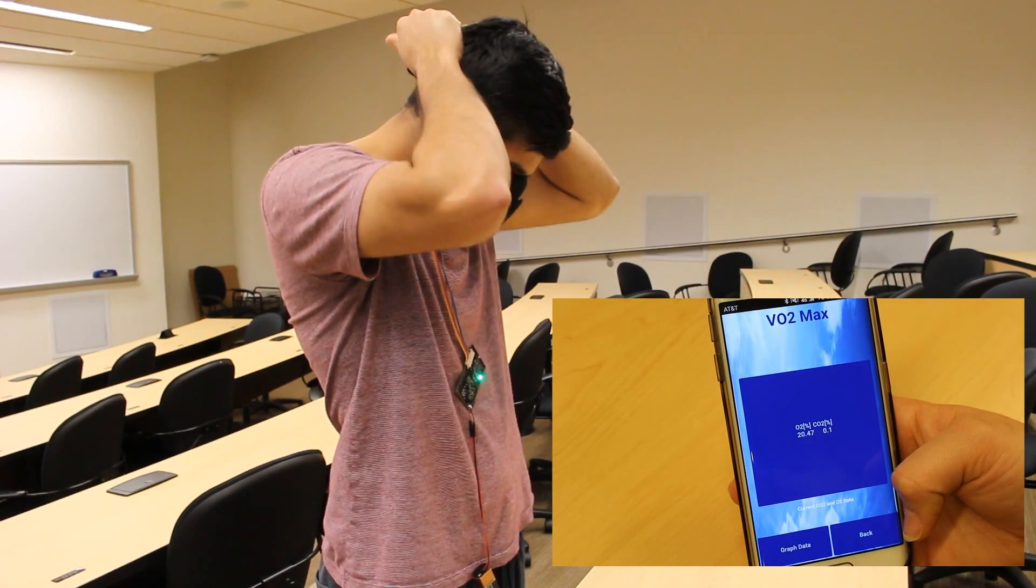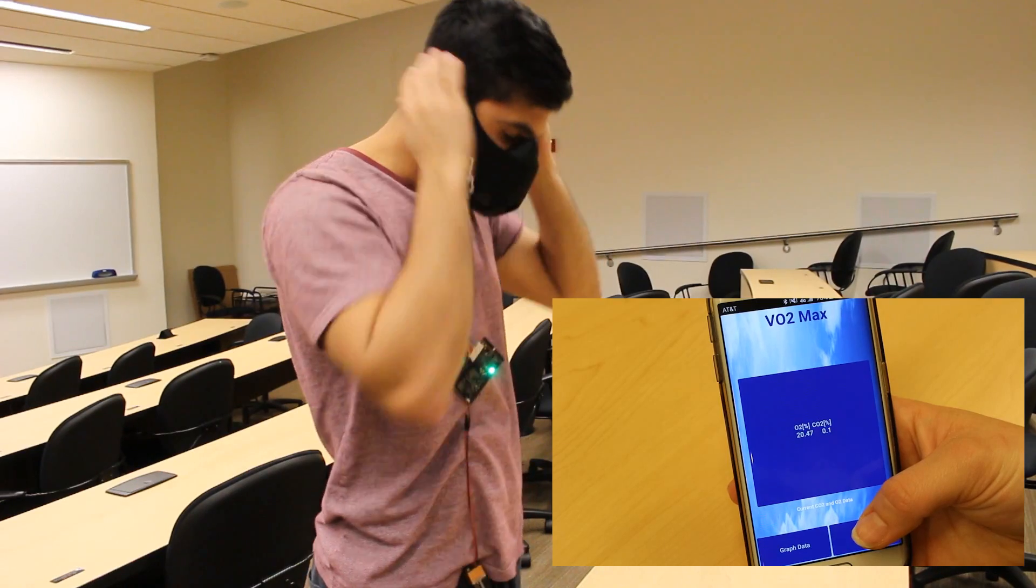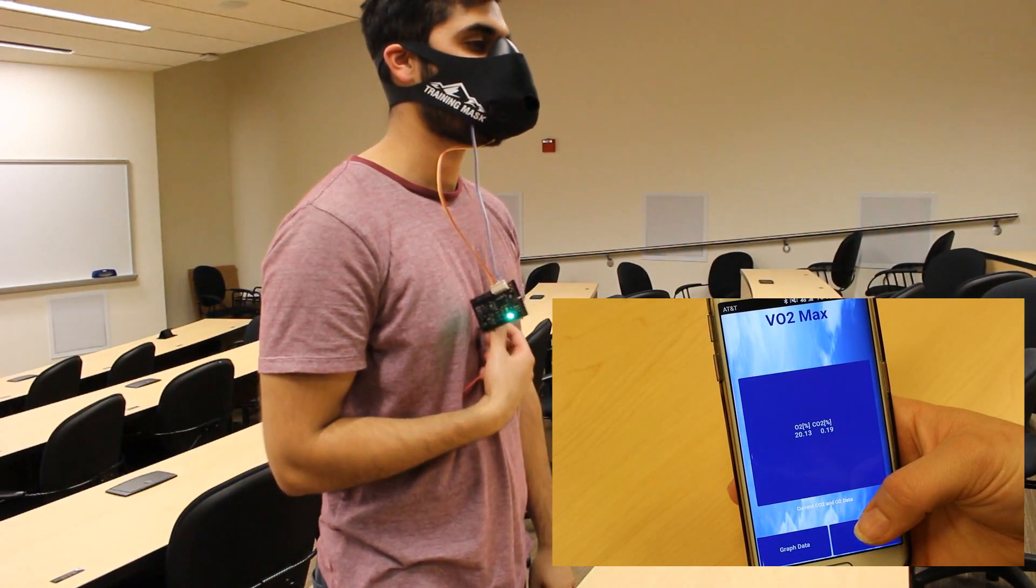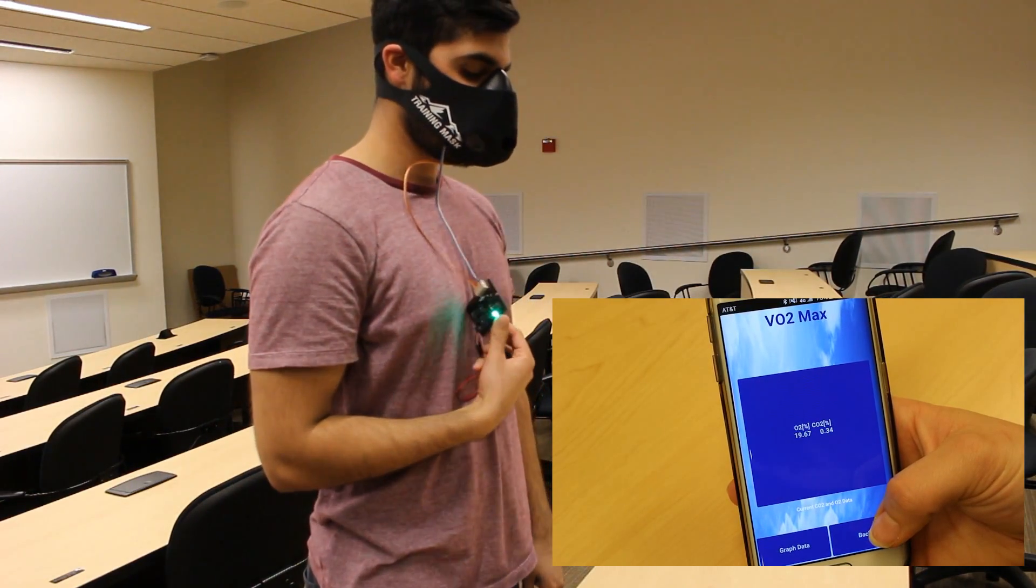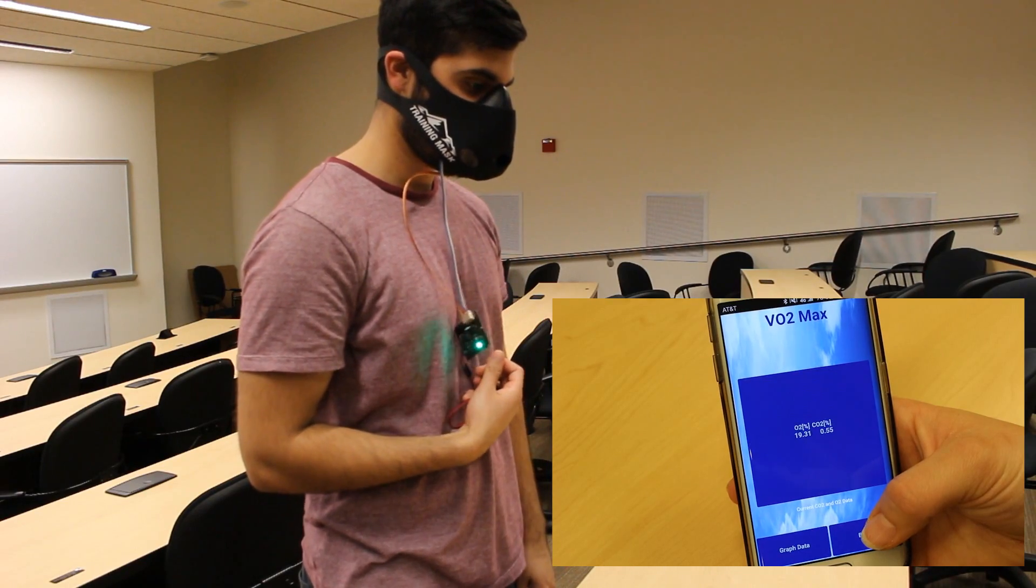You will also be able to see the live data updates directly on your phone through the Uku app as the CO2, O2, and activity levels change.